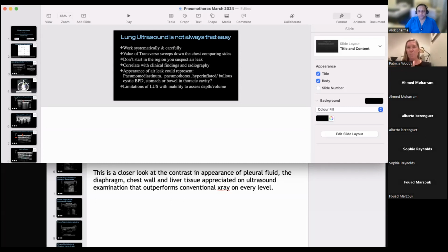So like the thymus or the diaphragm coming in. So that helps my laterality, so someone else reading knows that that's a left costophrenic and things. So rather than just looking at the chest wall, you've got to annotate. I find that helpful. And I think starting with the focal line just below the pleural line really helps, setting your 2D grayscale to the tissues. And again, that's where the thymus comes in for me. So you're just getting that nice, comfortable gray, blacky gray, all 50 shades, and going on.